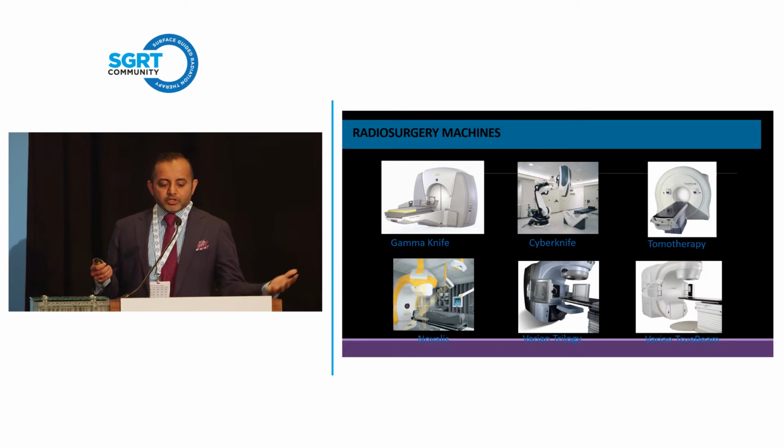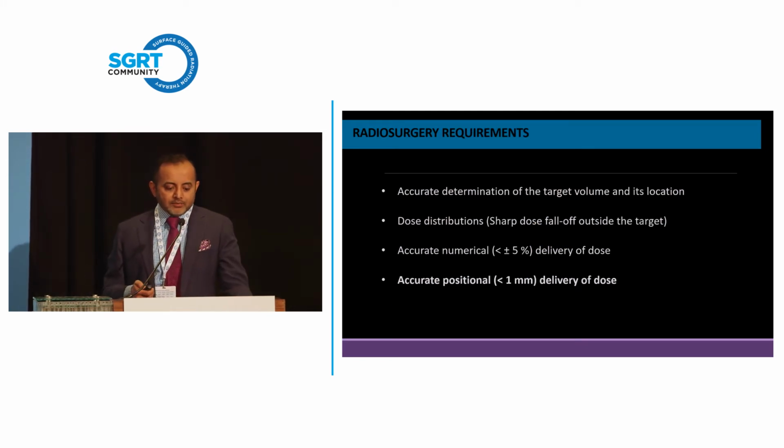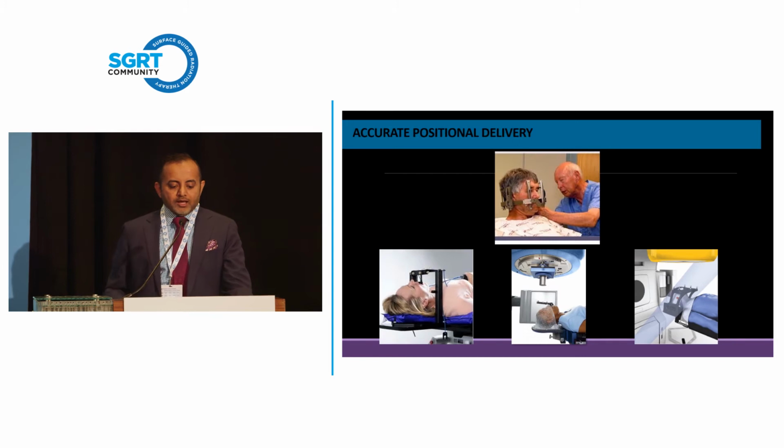So in terms of radiosurgery, we all know this. We give these very high focused doses of radiation. We ensure that the radiation dose drop-off is very rapid. We have these exquisite planning systems. But the key things that then come into play are accurate delivery of the dose and accurate positioning. And this is where, gone are the days of putting frames or big masks. We use these open masks that you can see on a daily basis. And image guidance really allows us to treat exquisitely accurately in a very quick manner.